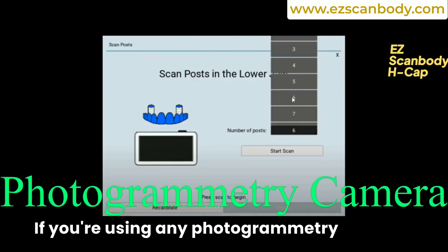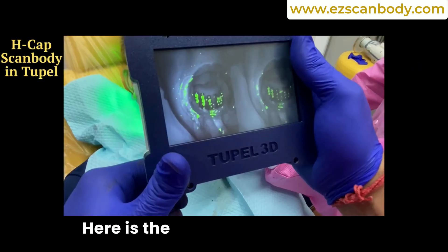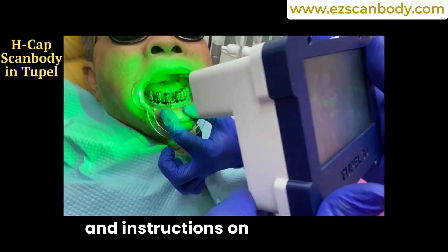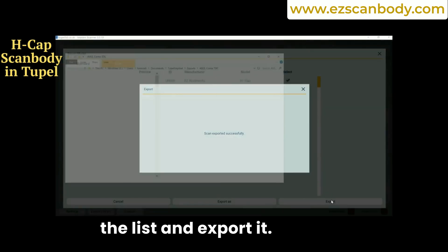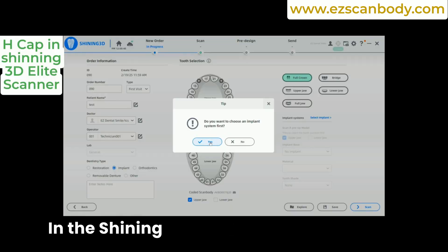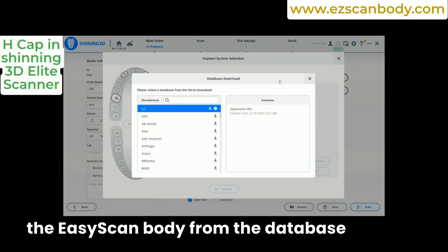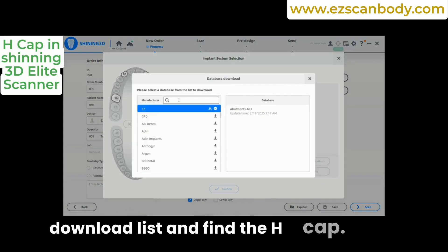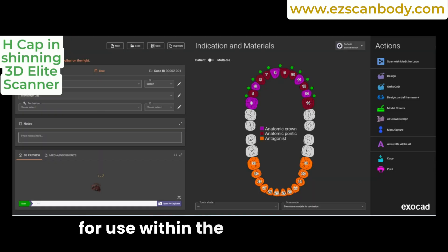If you're using any photogrammetry system, you can find the H-CAP in the library. Using the Tupel camera, go to the Export section, find the EZ H-CAP from the list, and export it — Tupel will save the file as an STL file. In the Shining 3D implant system, you can download the EZ scan body from the database download list and find the H-CAP scan body; Shining 3D software automatically converts it to the appropriate format for use within the system.